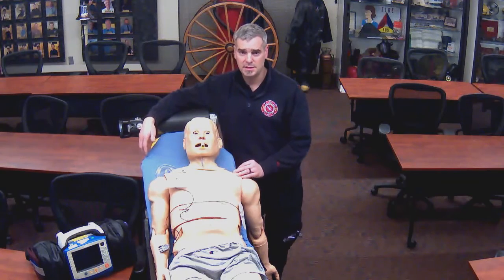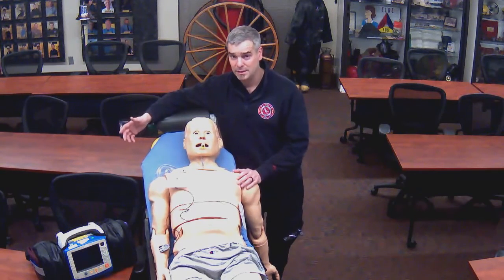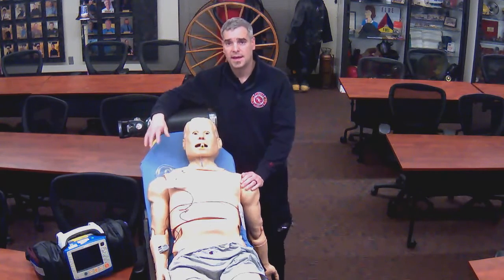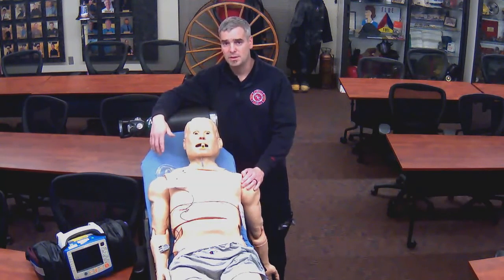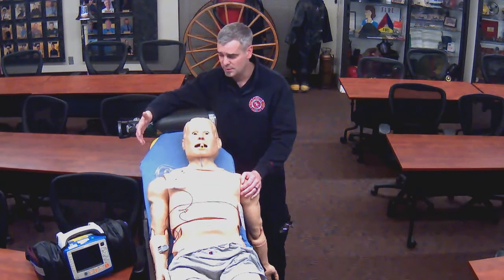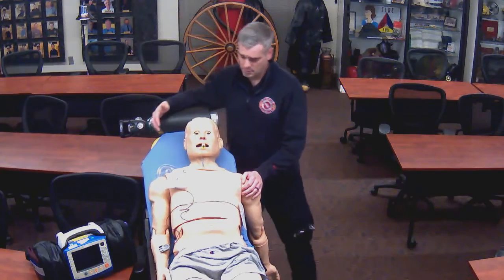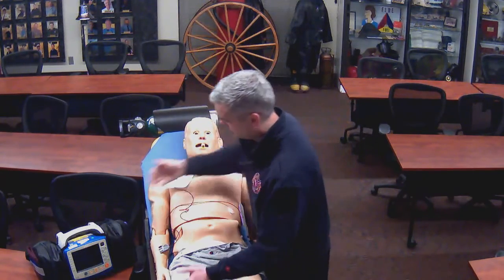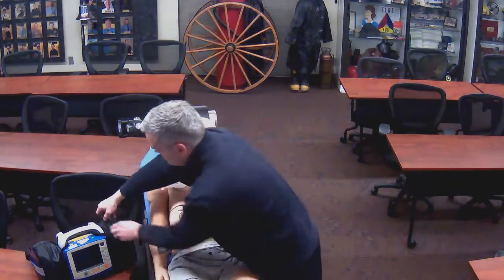When a patient is fainted, showing signs of cyanosis, terrible blood pressure, things like that that identify them as an unstable patient, we're going to move to electrocardioversion, synchronized electrocardioversion. That's where our Zoll X series monitor comes in. We've identified them as unstable. We're going to turn on our monitor and pull out our cardiac patches.